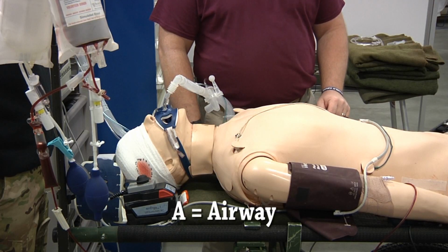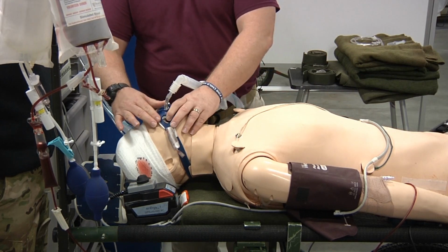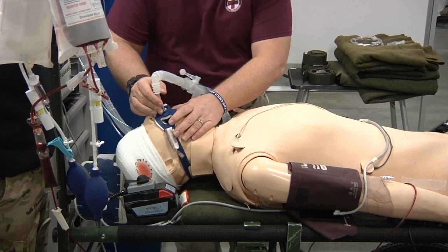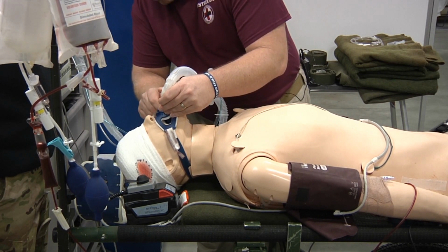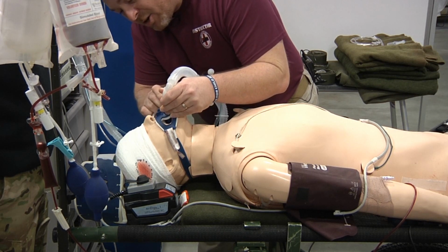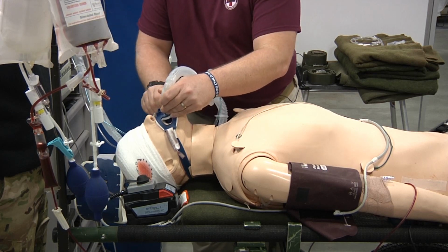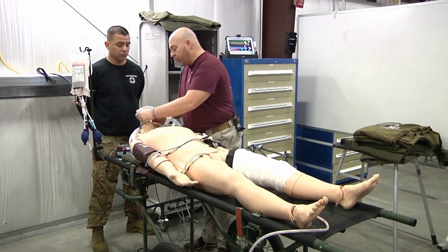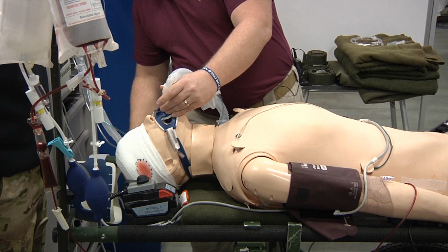Now that we've covered H for hemorrhage, we're going to look at A for airway. When looking at the airway, you simply want to check for security. Most importantly, ensure that the airway is secure. You're going to look at position, and you're going to look at the depth. So let's see, we are in a 7.0 ET tube, 24 at the teeth. We're going to ensure that our ET tube holder is in place, that it's properly securing the ET tube. We're going to flag it.